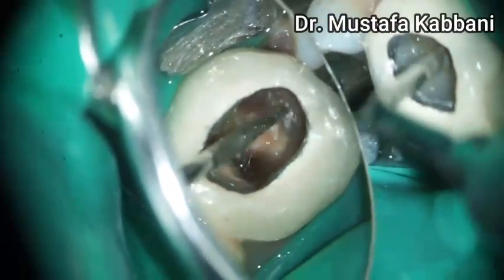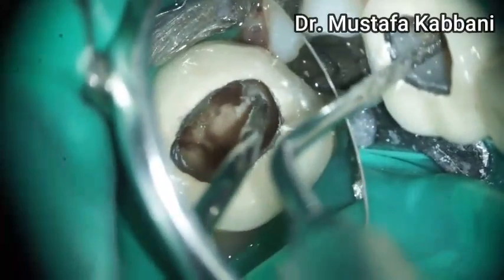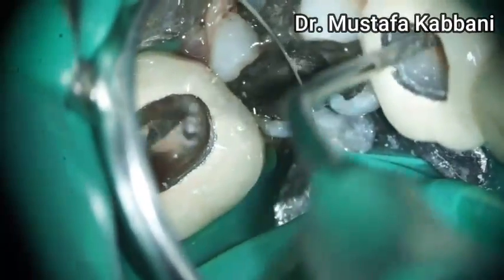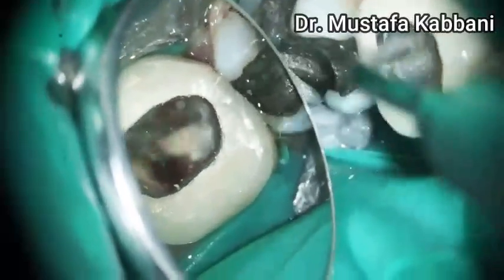Using ultrasonics in searching for suspected canal is very important to avoid any possible perforation and to keep the work more conservative.